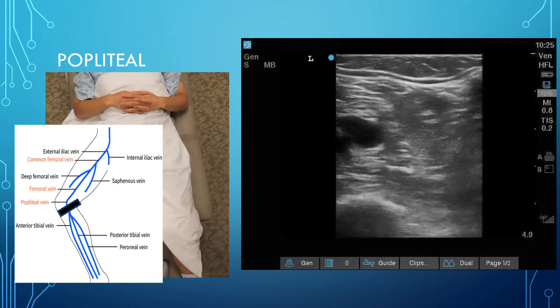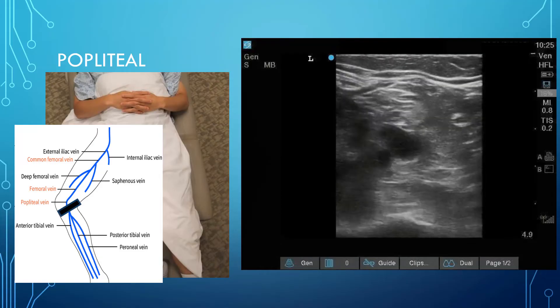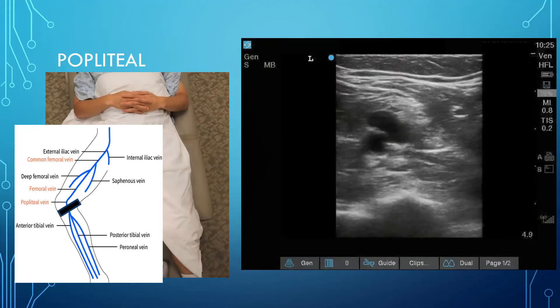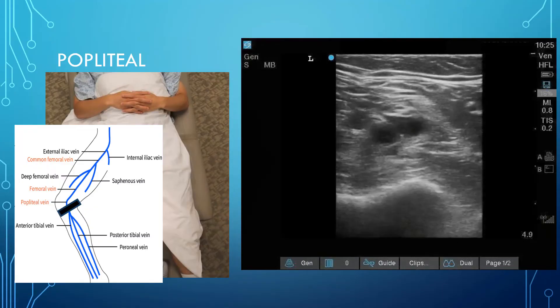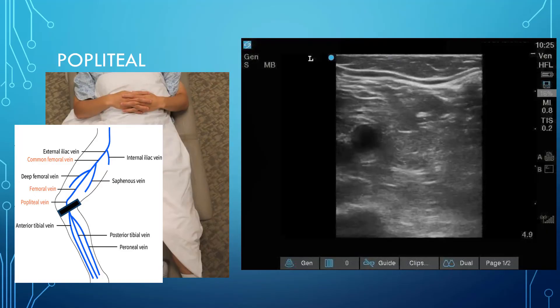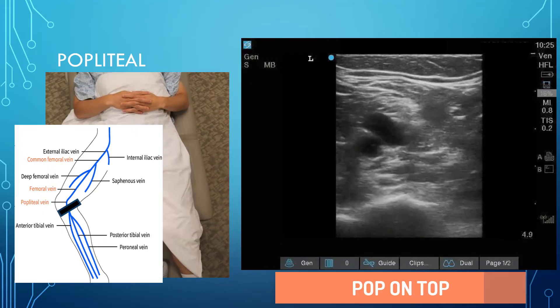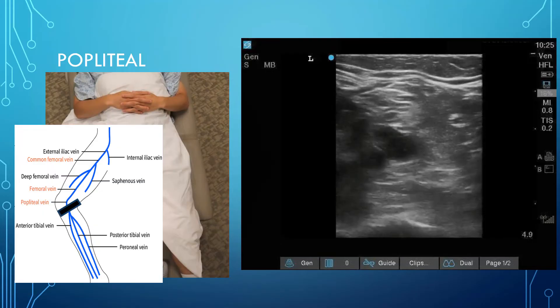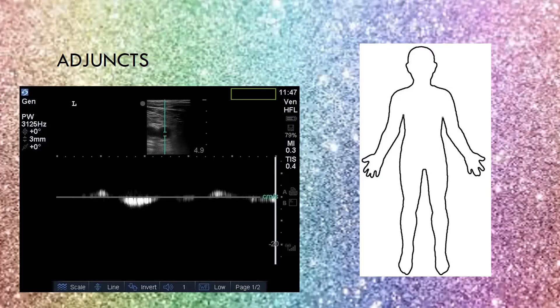Now for the popliteal. A common pitfall for beginners is that it's hard to find the popliteal vein because they're pressing too hard — it's a very collapsible and superficial vein, so try reducing probe pressure and it may come into view easily. Remember: 'pop goes to the top' — the popliteal vein is on top of the artery in this view. You should see the popliteal vein completely compress. The three calf veins — anterior tibialis, peroneal, and posterior tibialis — form the popliteal vein.